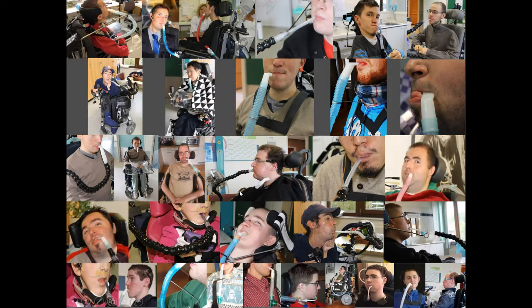Sometimes they use the mouthpiece on the right side, sometimes on the left side, sometimes in front, sometimes coming from the bottom, as you can see here. So you have many different systems. It means that you have to work with your patient to customize the position of the mouthpiece a little bit.